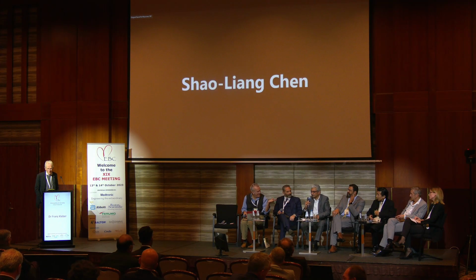Yes, because when we had a show of hands, everybody in the audience had used drug-coated balloon in the bifurcation setting, despite there being no solid randomized controlled trial or clinical trial. And it does make sense. Obviously, we don't have data because we have not conducted a proper randomized study, which is relevant clinically. Because obviously, if it's a small side branch, you won't be looking for mortality benefit.